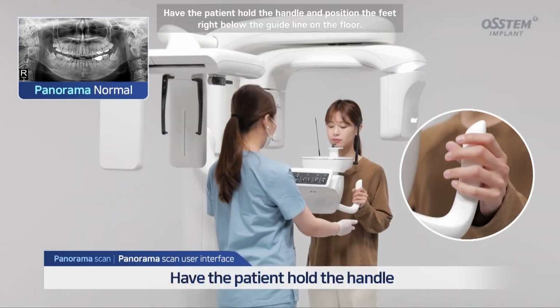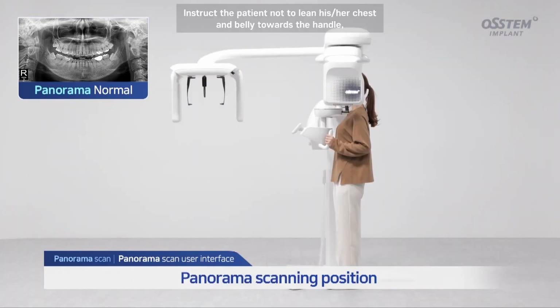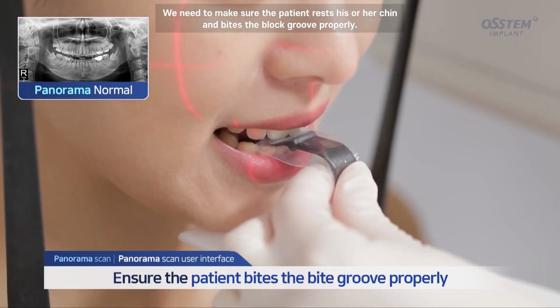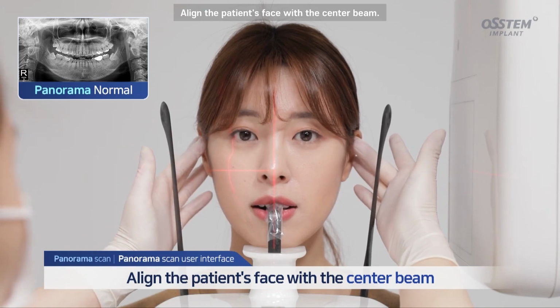Have the patient hold the handle and position the feet right below the guideline on the floor. Instruct the patient not to lean his/her chest and belly towards the handle, and make sure the patient stands straight. We need to make sure the patient rests his or her chin and bites the block groove properly. Align the patient's face with the center beam.